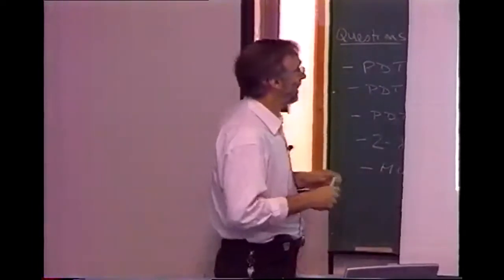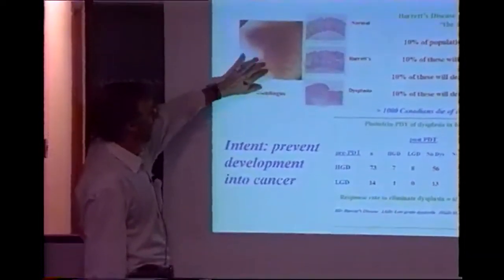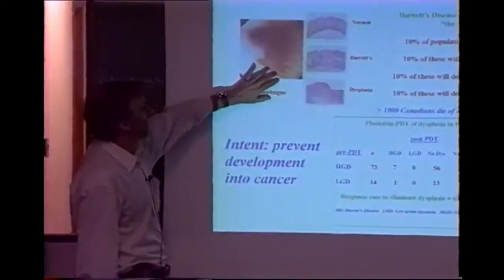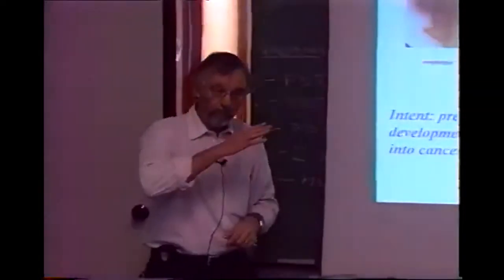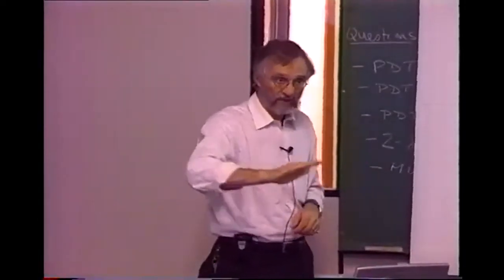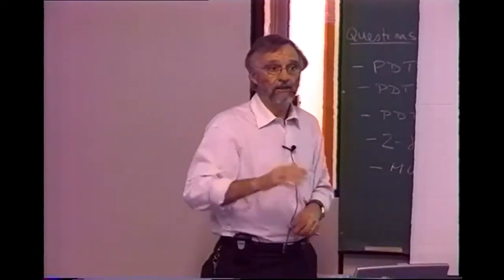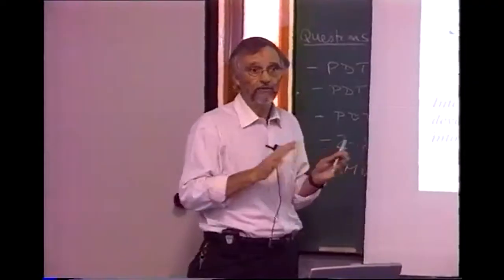There's another technique that's recently been introduced called endoscopic mucosal resection, where they use an argon plasma to completely strip the mucosa just by physical energy. And that may be competition for PDT. It does not require a drug. You can monitor exactly what's happening.